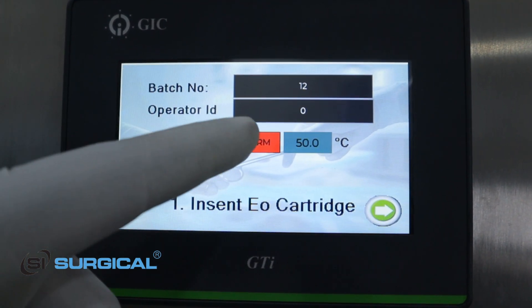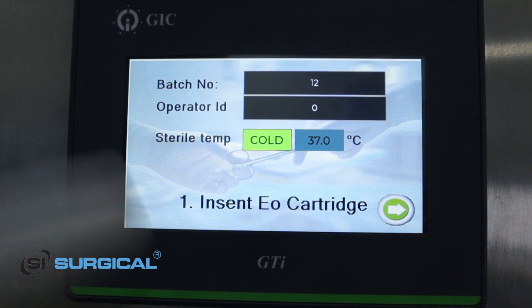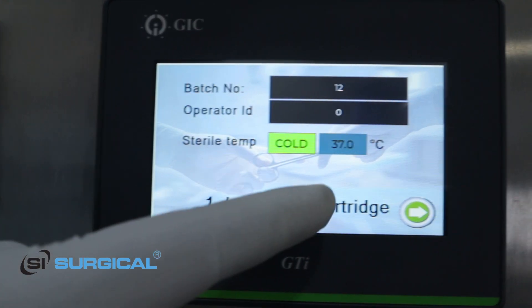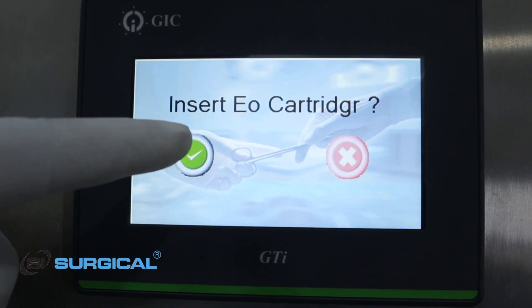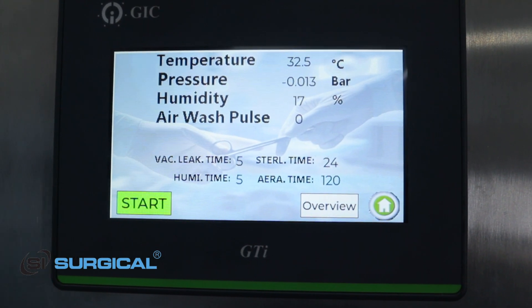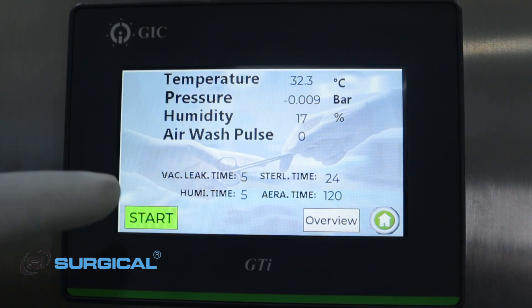I can set the temperature: cold at 37 degrees or warm at 50 degrees. I am going to set cold first. It prompts to insert the EO cartridge — yes, I have inserted it. After confirming that I have inserted the EO cartridge, I have to start the process.